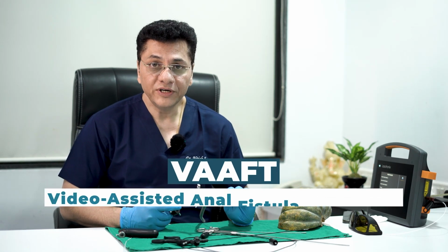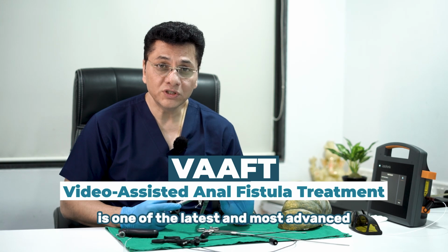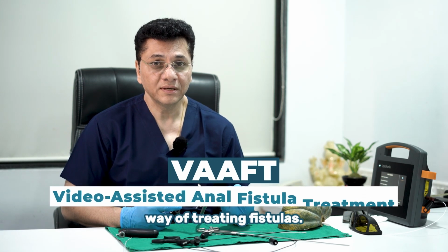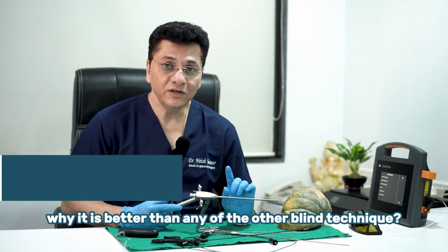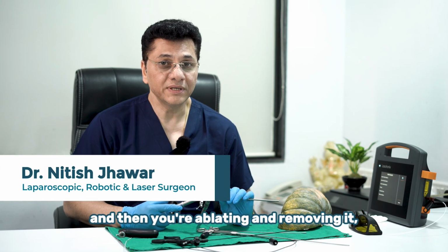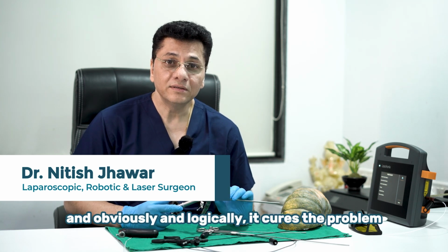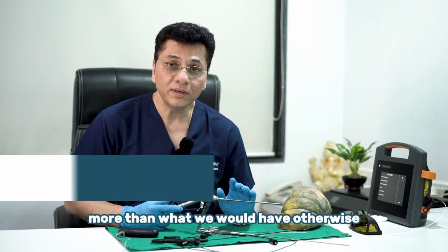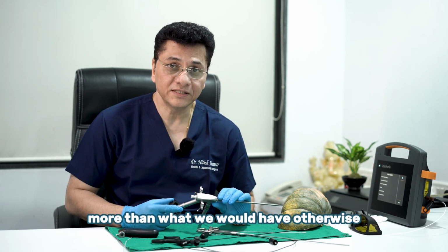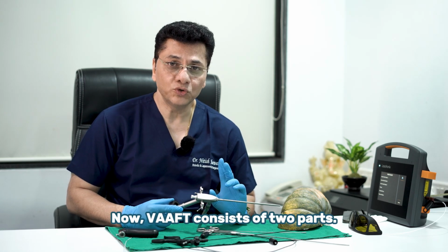VAAFT, or Video-Assisted Anal Fistula Treatment, is one of the latest and most advanced ways of treating fistulas. Why is it better than any of the other blind techniques? Because you are seeing the thing and then ablating or removing it. And obviously and logically, it cures the problem more than what we would have otherwise done if we did it blindly. Now, VAAFT consists of two parts.